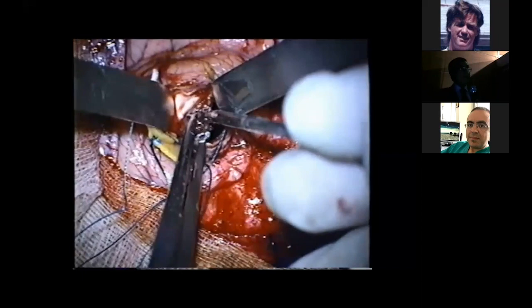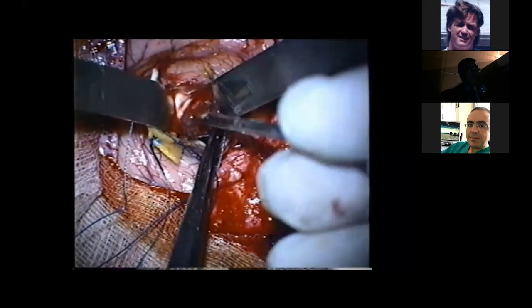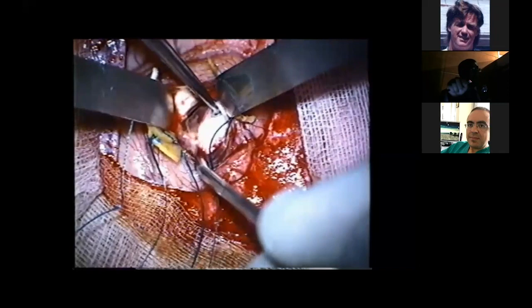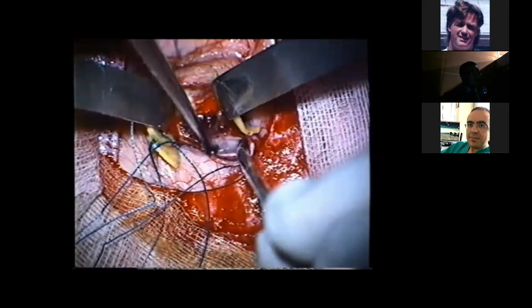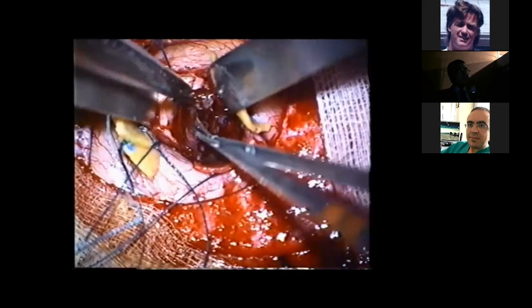Again, here is the low, this is below, this is above, this is anterior, this is posterior. So we are in the superior temporal area at the junction with the parietal lobe at the marginal and supramarginal angular gyri. So the tumor here looks okay. I was happy. Oh, there is a good plane of cleavage. It looked ugly. To me, this is not good.